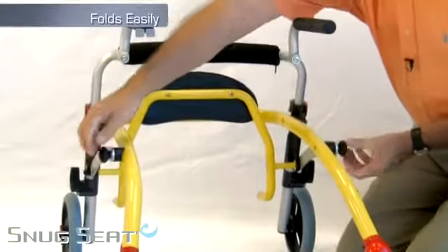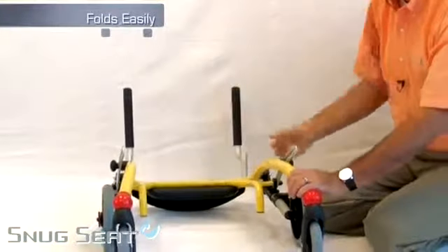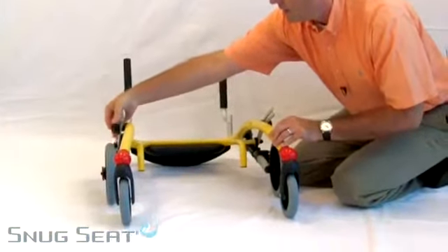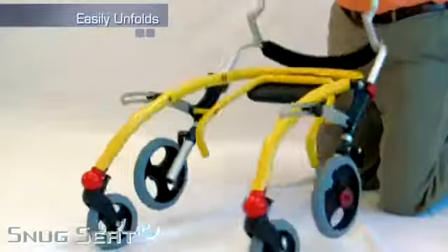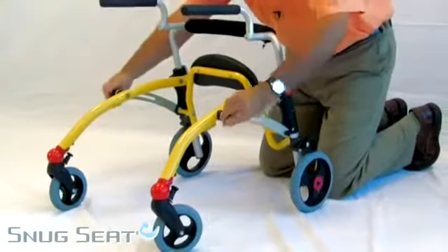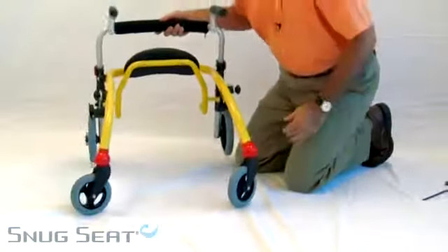The Crocodile folds easily for transport in an automobile by loosening the knobs and simply folding the frame flat. Tighten the knobs and it is ready to go in the trunk. Loosen the knobs to simply unlock the frame, tighten the knobs, and you are ready to go.